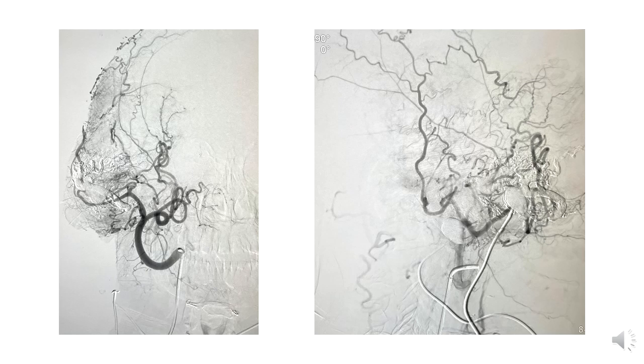different collaterals. Similar kind of thing can also be done for arteriovenous malformations, not only for these direct puncture superficial lesions, but also in the brain or deep-seated body arteriovenous malformations and tumors as well. So here, only the central part is embolized, and we still have a lot of tumor to cover.